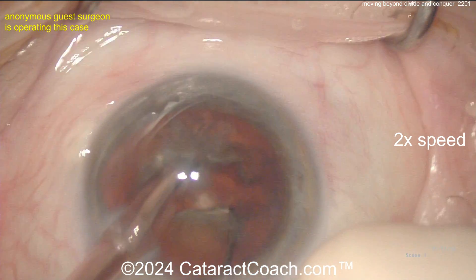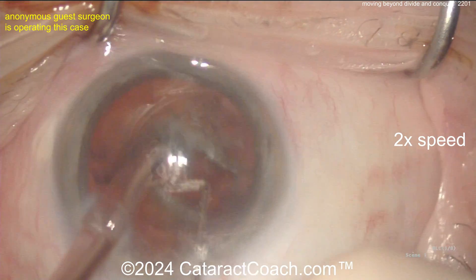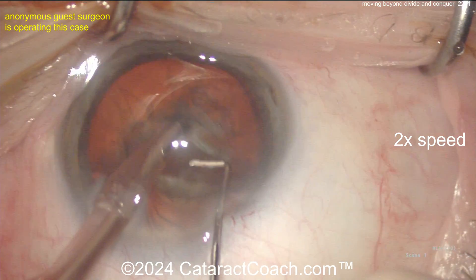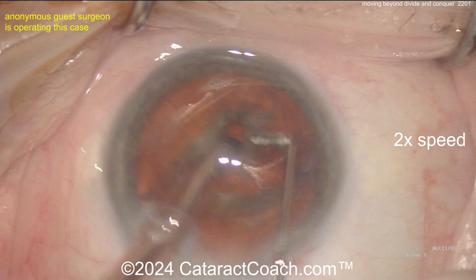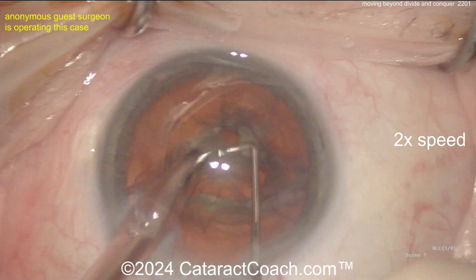Okay, just trying to crack it — that's a pretty reasonable crack or separation, but I don't know if it propagated all the way through. Part of the issue is I think the groove was not long enough. Okay, so now what — maybe not quite stop and chop here, maybe a little divide and conquer again, making another little groove and trying to break up a little quadrant.